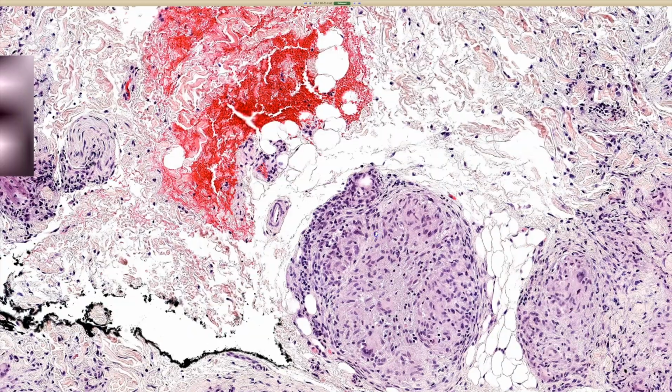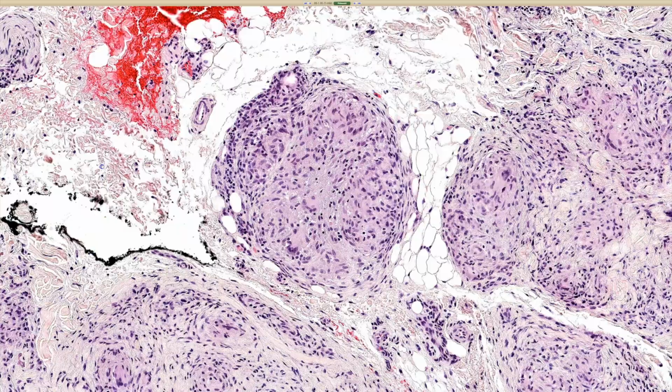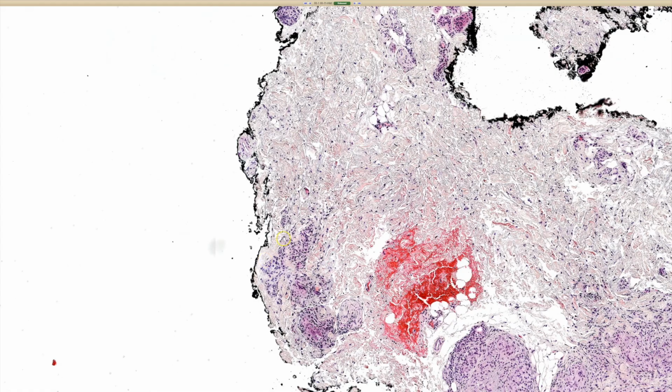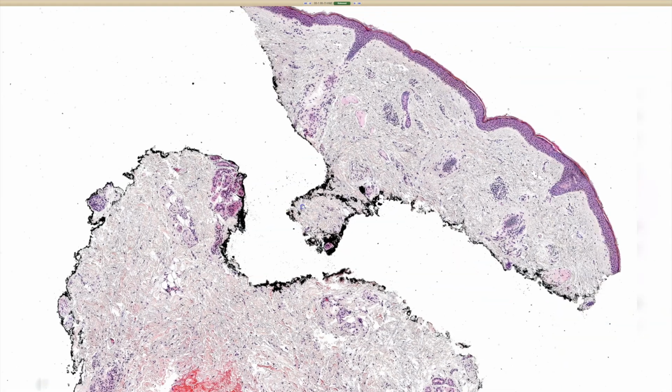It means you've got to hunt around forever. And sometimes you don't find any organisms, but then you do cultures or molecular testing and you find that there are organisms there. Like tuberculoid leprosy, for example, or actual tuberculosis. So yes, in real life, we have to work these patients up, make sure they don't have anything else, and make sure that the clinical pattern fits for sarcoidosis.